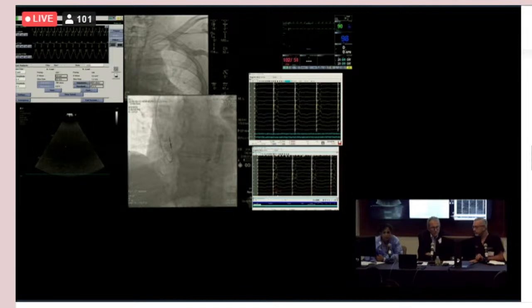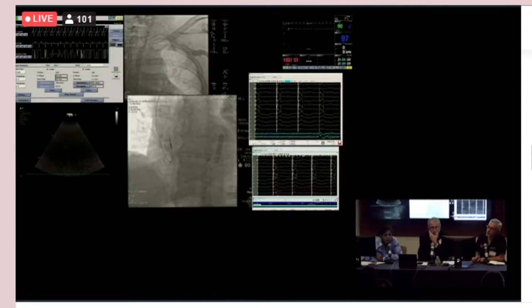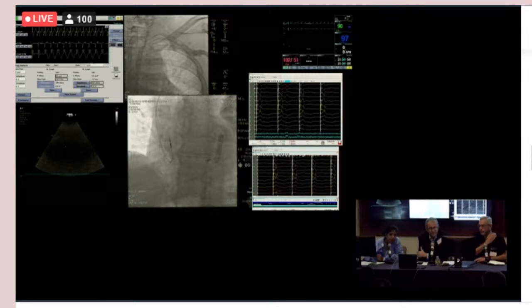So this is the final out. We've already cut away the leads, so this is unipolar pacing. Does anyone have any experience with the other leads, with Boston Scientific or St. Jude? Yes. They're all stylet driven leads, and Abbott has their own His Pro sheath, Biotronik has their own Selectra sheath. So they're all developing sheaths, but you have to drive them in with stylet. And actually, it's sometimes easier because you have the backing of the stylet. Longevity is not clear, but the shape of the sheath is what's key to get it in.